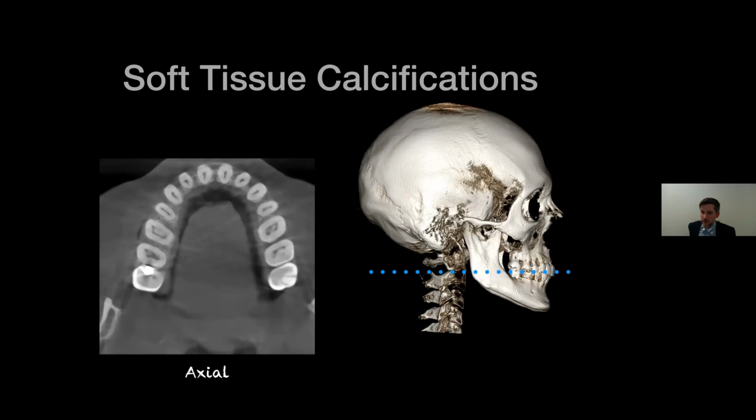I feel like I already answered the question about cone beam versus intraoral bite wings. So I would take a bite wings, either extraoral or intraoral, for incipient lesions, as opposed to diagnosing those off of the cone beam. Yes, a general practitioner can write a report.